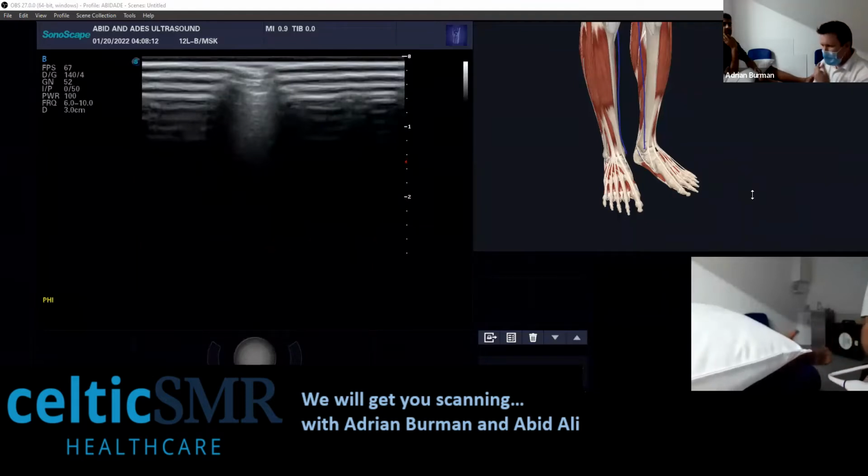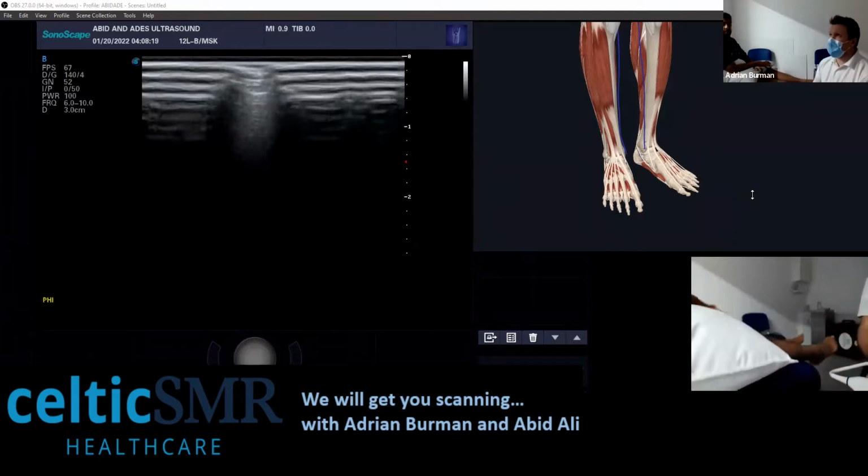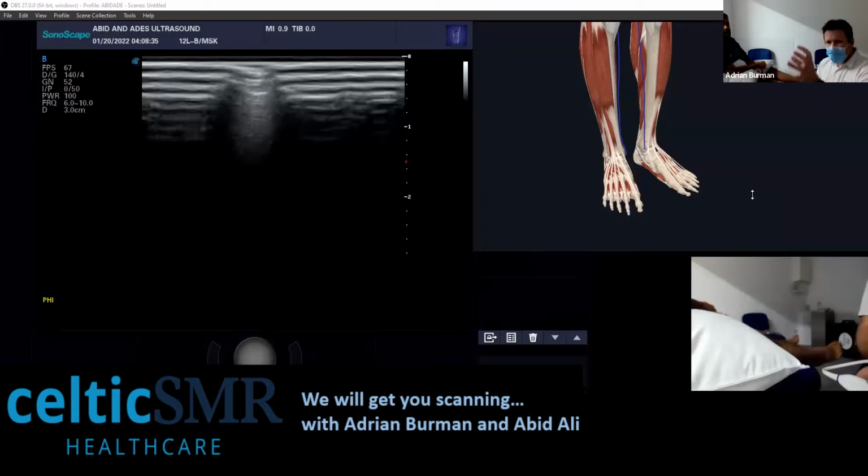Anywhere where you struggle to get your penetration. I can only think of the neuroma at the moment, but because the skin's quite thick and everything's dark, neuromas are inherently dark. So if you turn it too dark, then you're looking at dark next to dark, and it can just be a bit confusing. So if you turn the gain up, it might just define that's definitely dark, and that's not, more in the thickened sort of tissue areas.